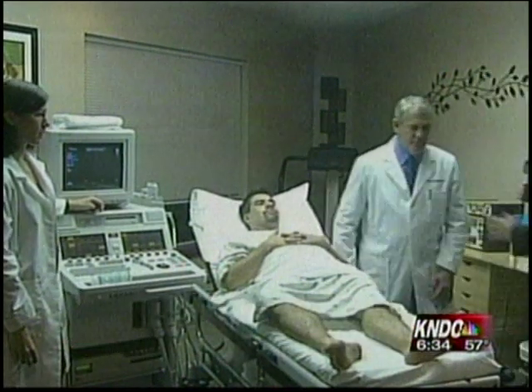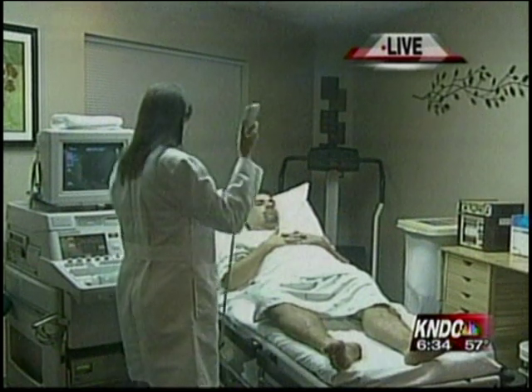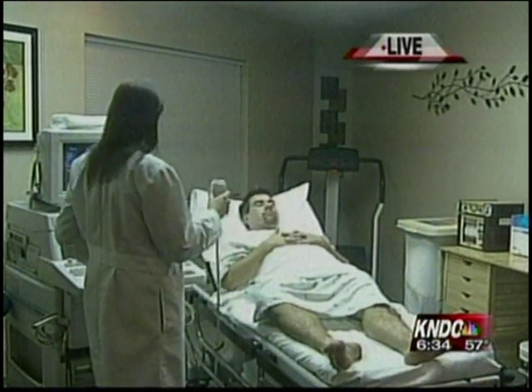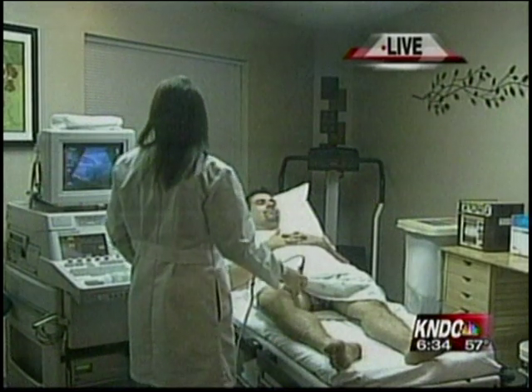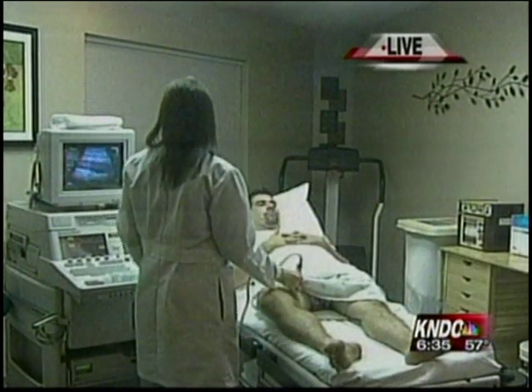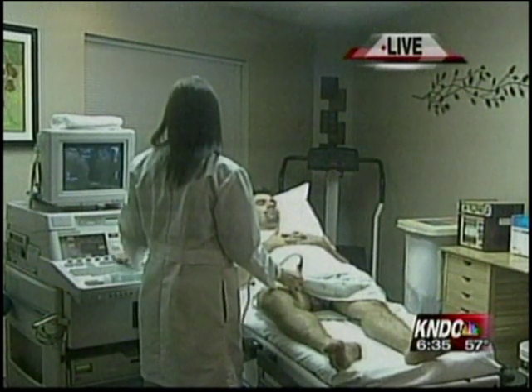So we'll step away, and once again Sarah's going to come in and start the test. Talk to us a little bit about what she's doing. Sarah's using an ultrasound machine and a transducer, projecting sound waves into the leg and finding the artery. And then when she does that, we can see plaque in the artery, and then we can use the sound waves to measure how fast the blood is going through the artery.